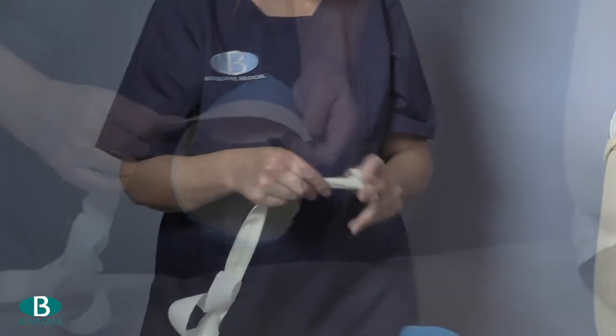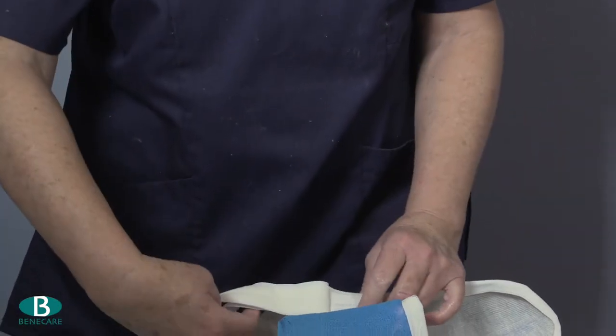Edge the brace with either elasticated strapping or fleecy edging tape.